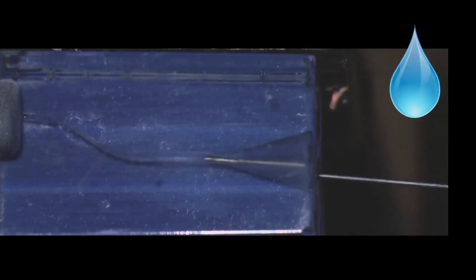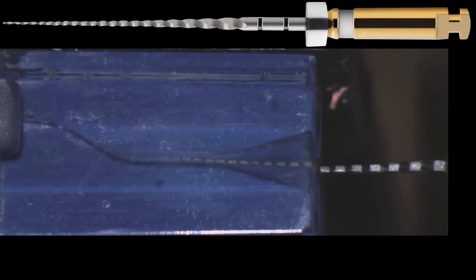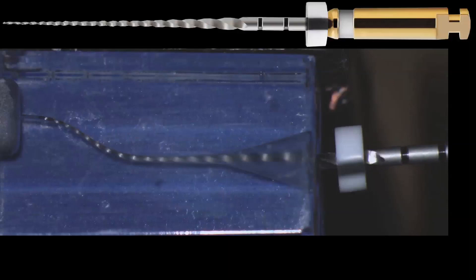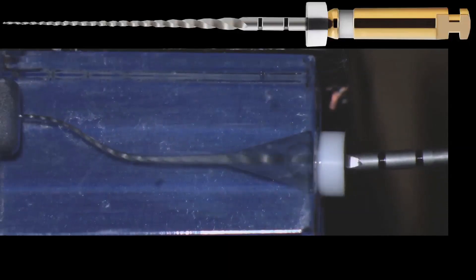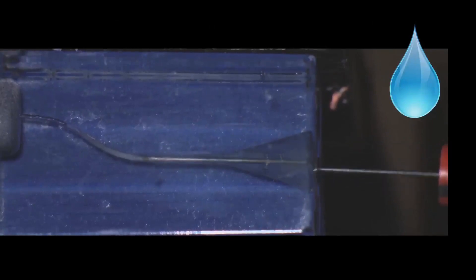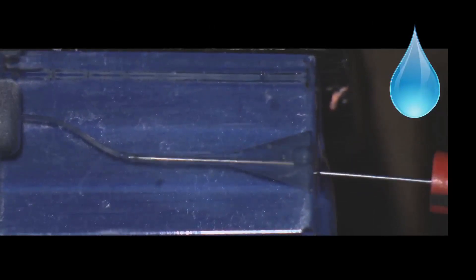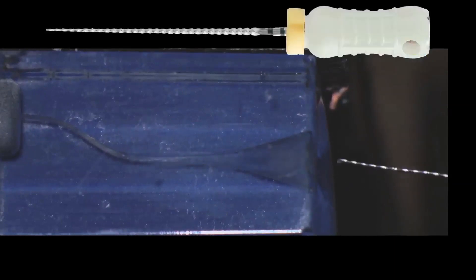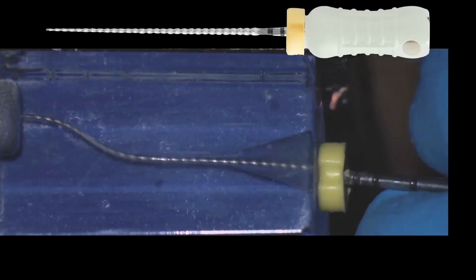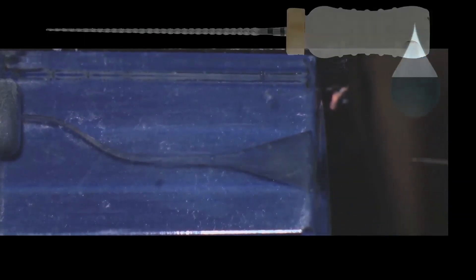Now we proceed to create the glide path. In this case we use the ProGlider. In increments of three millimeters, we go all the way to working length. We irrigate again. We ascertain that we have not blocked ourselves with the instrument that established working length. Then we remove the instrument and irrigate again.